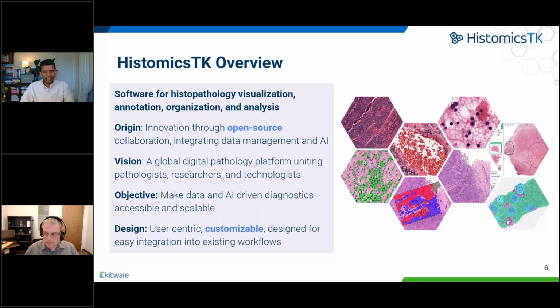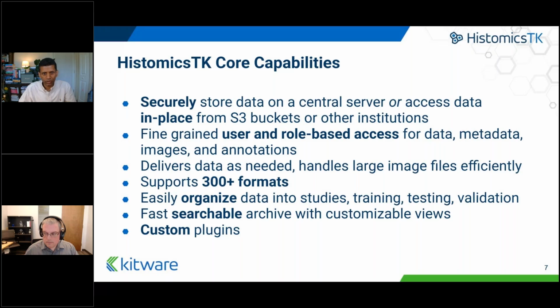At the core of HistomicsTK is our data management model. We start with extensible authentication, passwords, OAuth, and more. Then we store data securely in asset stores, whether that's local file systems, network storage, S3 compatible buckets, or even data housed at other institutions. A key feature is that we handle data in whatever format it already exists in.